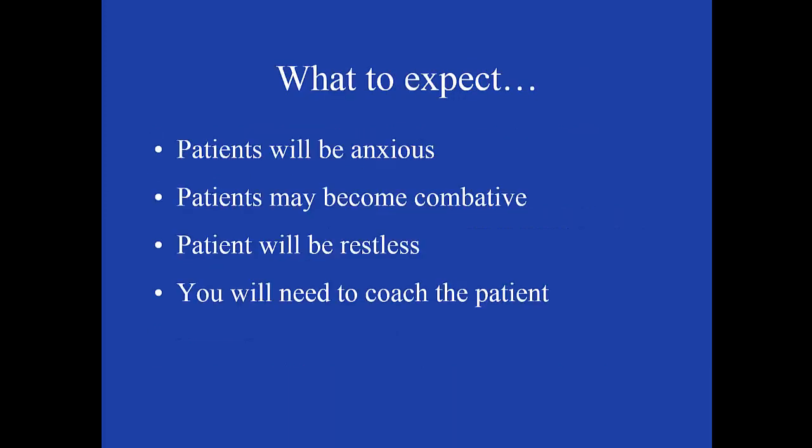So there are a few things you should expect anytime you apply CPAP to a patient. First of all, the patient may be anxious. Also, they may become combative. These conditions may be because of the hypoxia that the patient is experiencing, or simply that the device is unfamiliar or maybe a little claustrophobic. So expect that you're going to need to spend a little time coaching the patient on breathing with the device in place before they become comfortable with it.